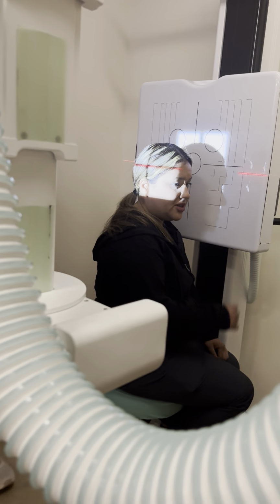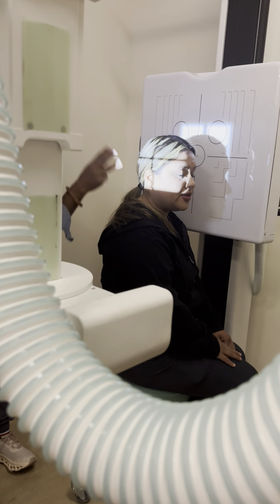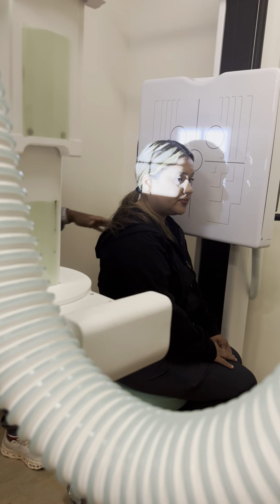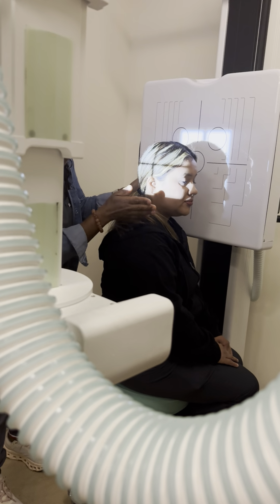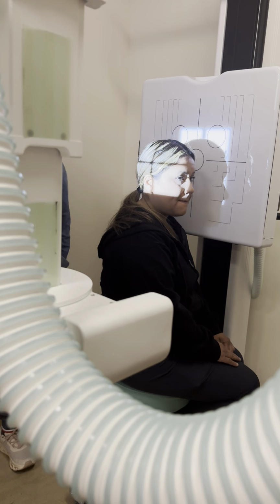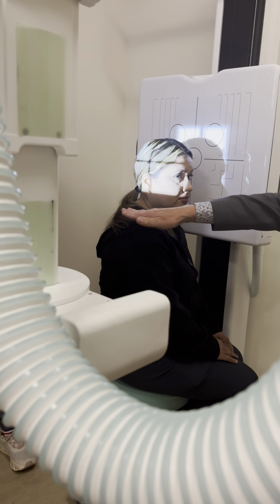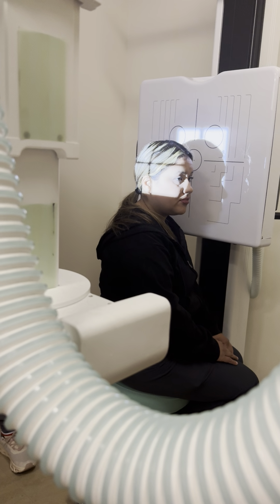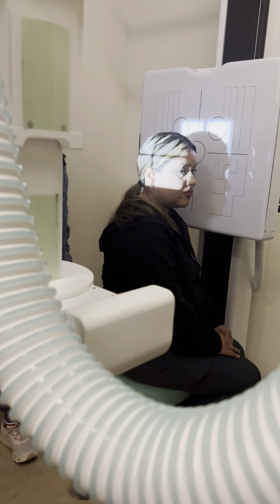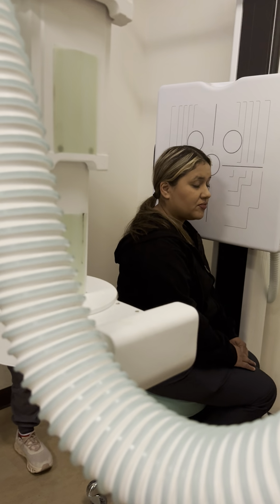So it wouldn't be simple. I'm trying to demonstrate we bring it down here and the infraorbital meatal line, and the lateral view is why I'm bringing it down first. So we're gonna be oblique. If you can figure it out without the red line, which later on you will be able to, that'll be great. But in the beginning, maybe it'll be easier to bring the line there, then reposition the central ray. Mo figured it out, but it's just one more thing, and we're learning a new process of it.